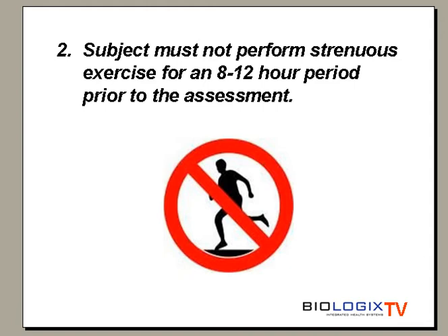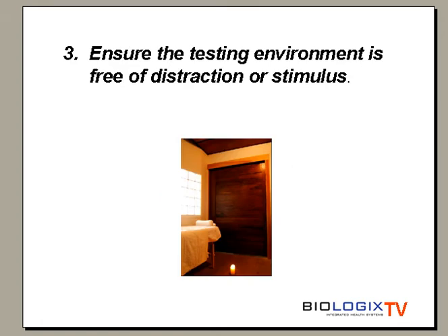Thirdly, your testing environment for RMR should be in a closed room, free of noise or distraction, where the client can rest comfortably while breathing. The key is free of noise or distraction, such as music or TV. A massage room is often perfect.